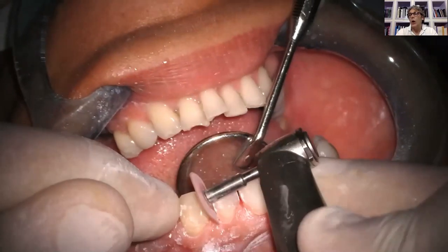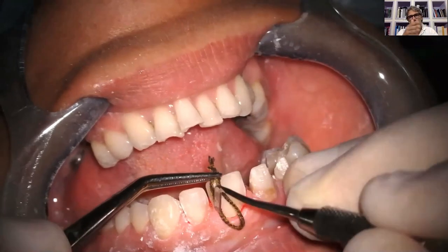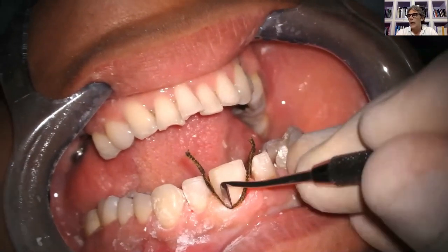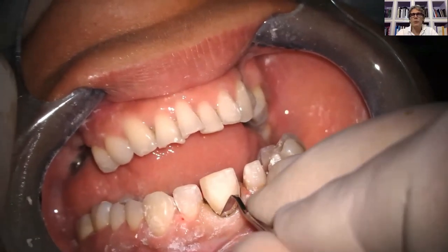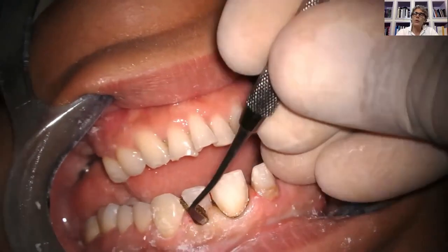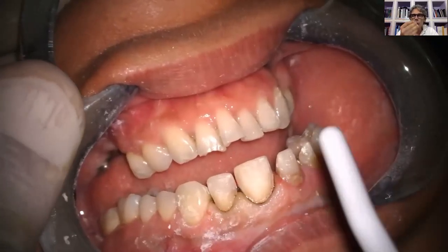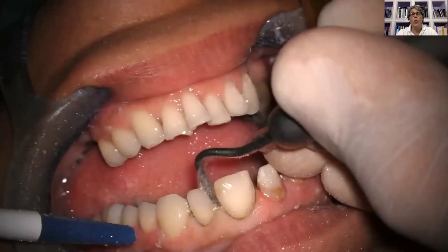After these first four steps, only in the next step will I position the retraction cord, because thanks to these procedures, only in this step, with the retraction cord, I will move the soft tissues around the preparation areas in apical direction, and thanks to this I am able to better highlight the finishing line preparation in the third cervical. We have to do this because it's simpler to scan the finishing line preparation completely outside the gum. Again, I underline another time, we have to prepare supragingival or at the gingival level.